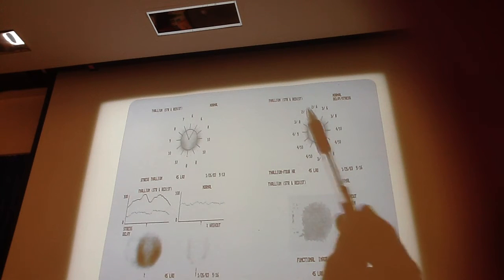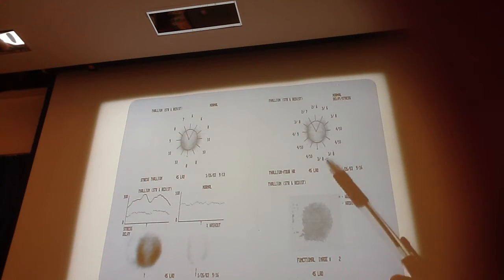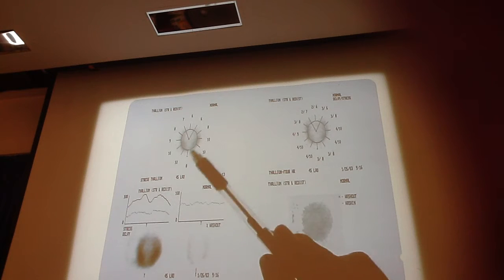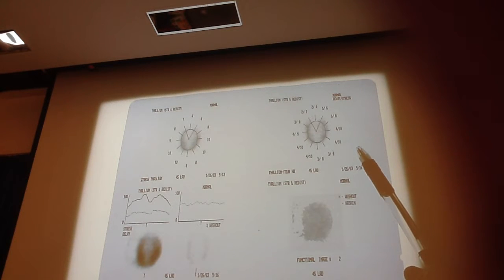Okay, does that make sense? Over here we have a 3 to 8, so roughly a 50% washout. Down here we got a 4 to 10, so a 40% washout. So as long as you have 30% or more washout, that tells you that you have good circulation. That's the bottom line. Okay? Because you not only look at the blood going into the muscle, but also the potassium as it washes out.